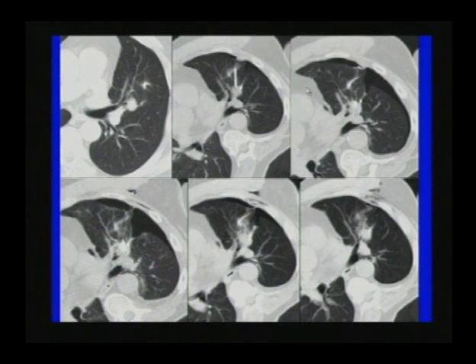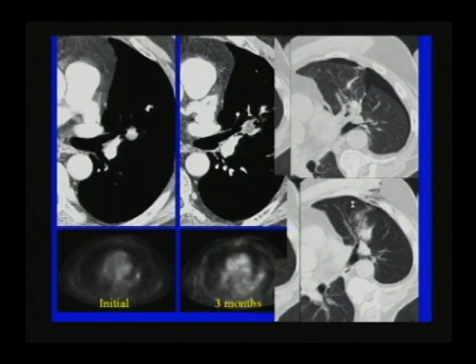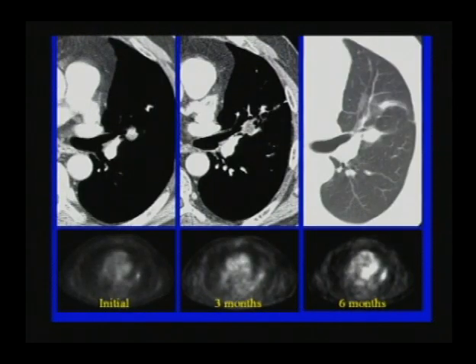We placed the lesion. Here's the intra-procedural pneumothorax, which occurs at all times. At the end of the procedure, when we withdraw the needles, we make sure that we evacuate the air. And that's a very important part of the procedures, to make sure that you have evacuated that air at the end. And then here you see that when we give contrast uptake, we're following this lesion, this area.